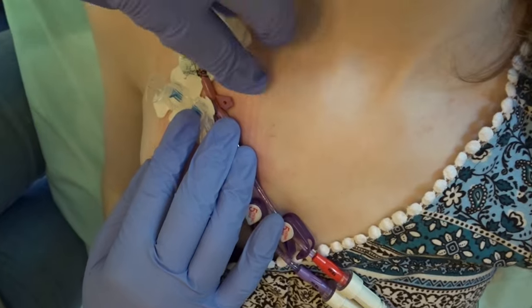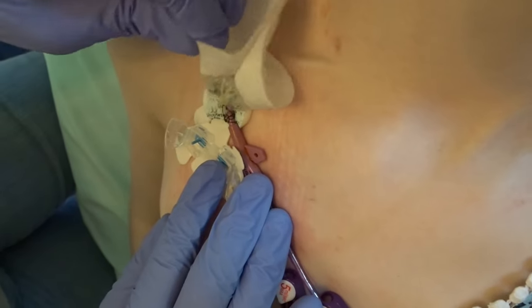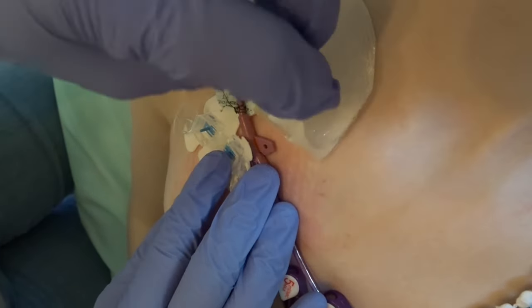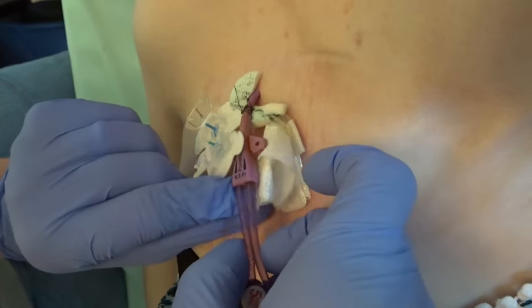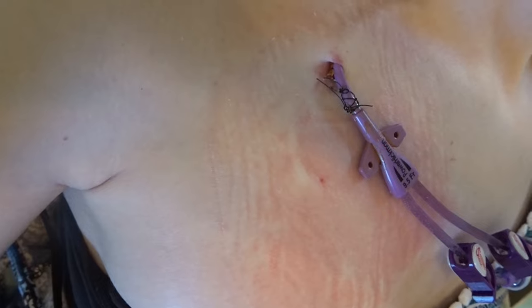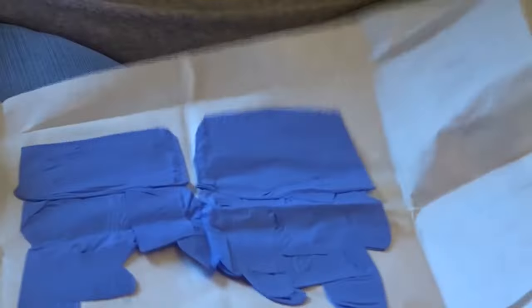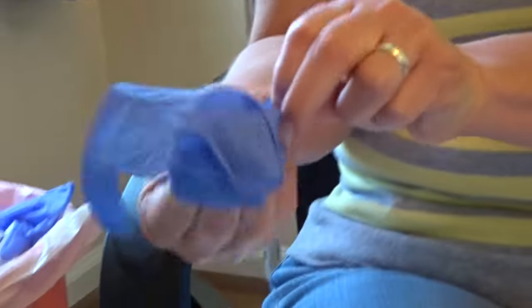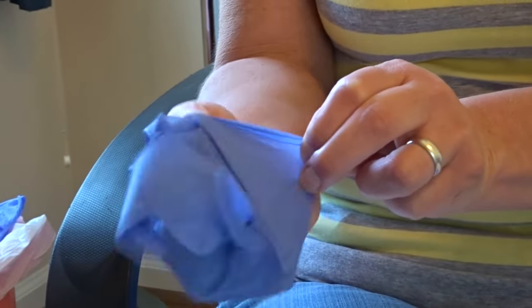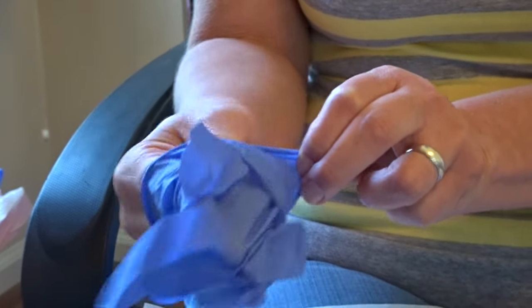After the old dressing is completely removed, it is time to get sterile. Sterile gloves are included in the kit. The one in my kit has aloe, which is not ideal for someone with sensitivities, so we use another brand. Open the package of the gloves — inside, the gloves should be partially folded upward, and that is the part you can touch. Once on correctly, the folded end will no longer be on the outside.